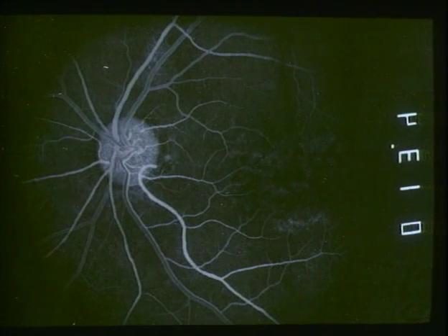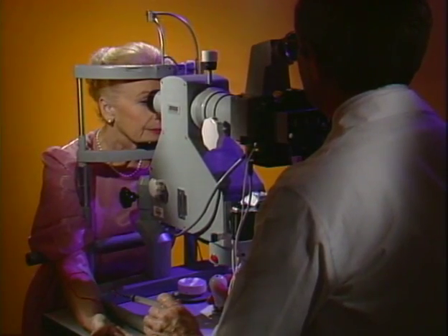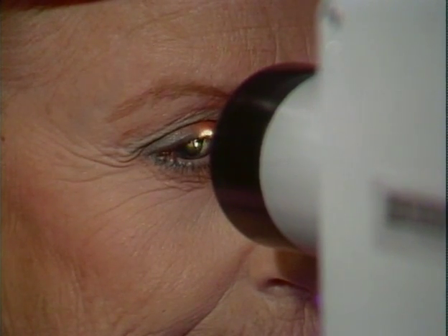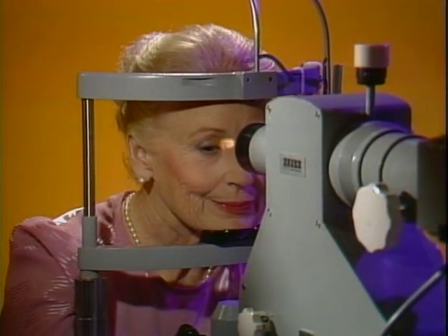Here's what the pictures will look like when they're developed — the dye makes blood vessels appear white. Fluorescein angiography is quite easy, causes little if any discomfort, and takes only a short time. And it provides very important information about your eyes that cannot be obtained in any other way.